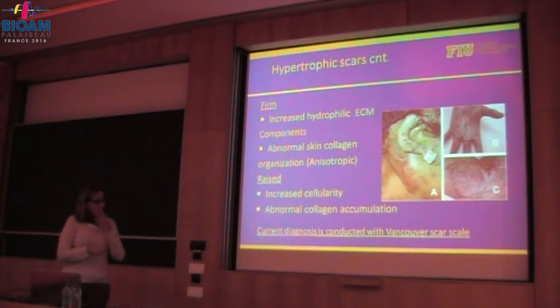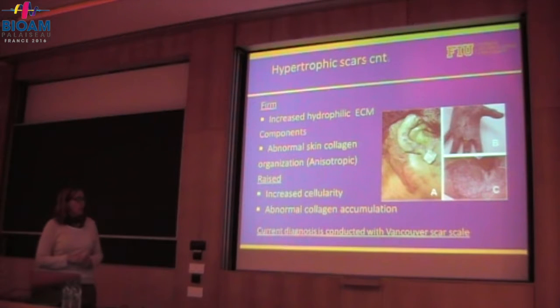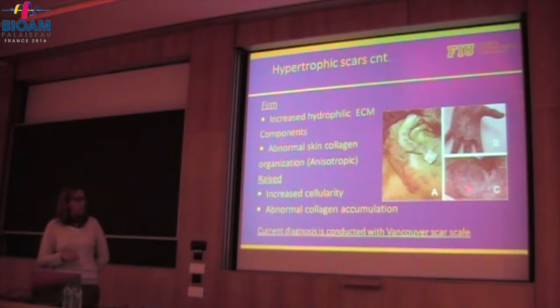So we got interested in this project. We had a burn center near my previous university in Washington, D.C., and they called us up to find a better way to quantify the evolution of a scar, given that present tools are just based on doctor observation, and particularly on a 1 to 5 scale called the Vancouver scar scale.